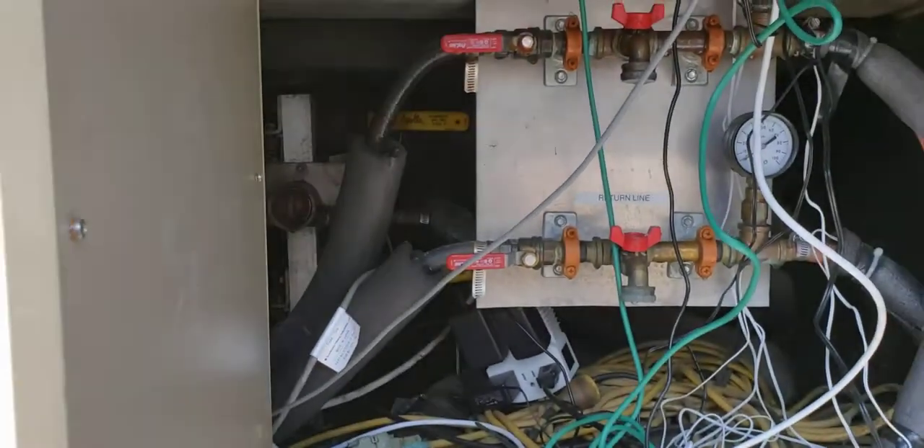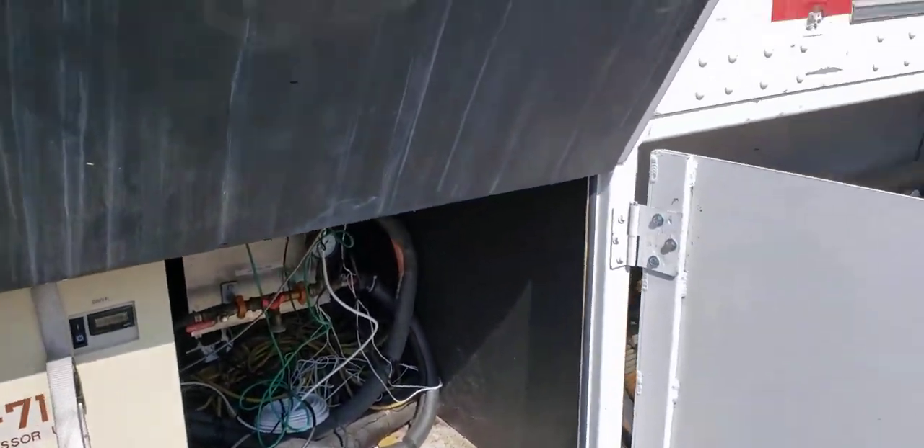The evaporator - the helium - is then used to cool down the magnets on the MRI machine. That is that section of it. I'm going to go around and show you the actual chiller now.